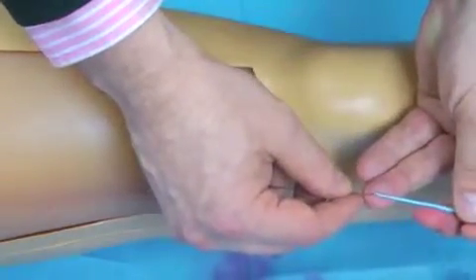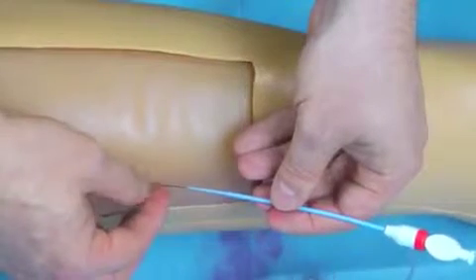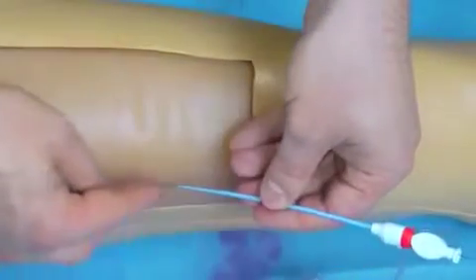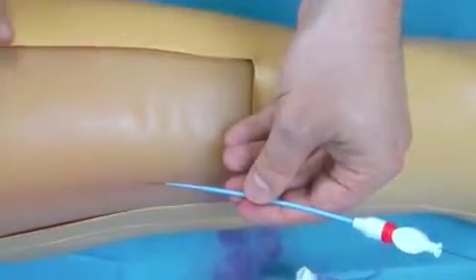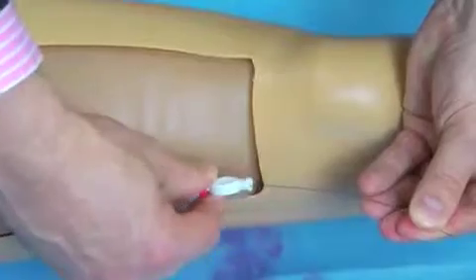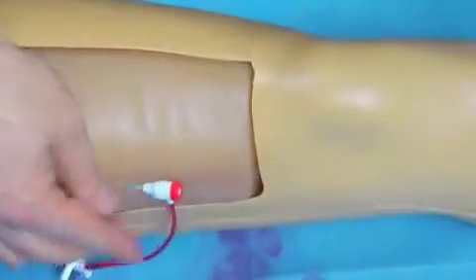What we do is we just pop the guide wire into the end of the introducer, and before we pass it into the skin itself, we just make sure that enough guide wire is coming out to the other end. This is essential, as within all catheter techniques, because if we push blindly through at that point and weren't holding the wire, then what could end up happening is the wire could be lost inside. So, making sure we're holding the wire safely, we can just slide this introducer straight into the vein, and once we're in this position here, we can then take out the wire and the introducer, leaving the cannula in place.